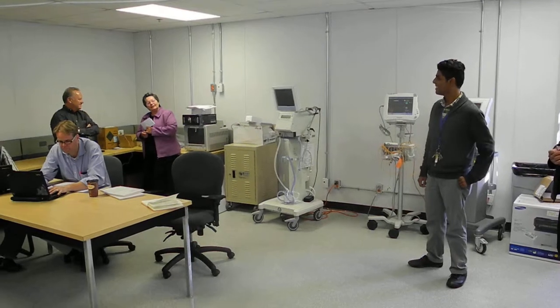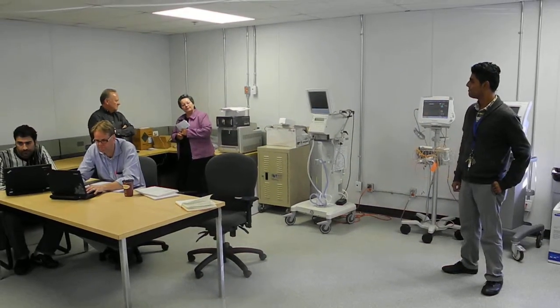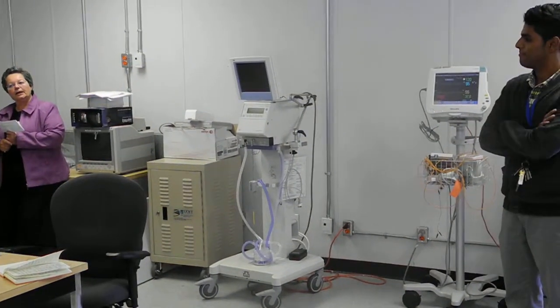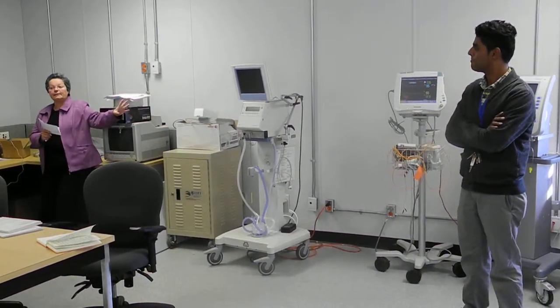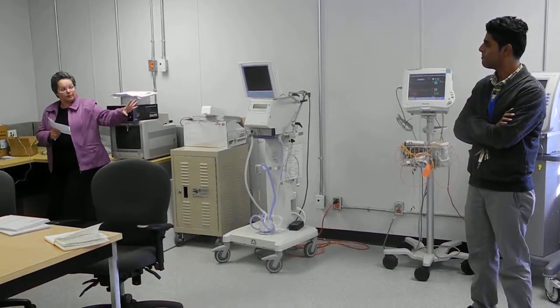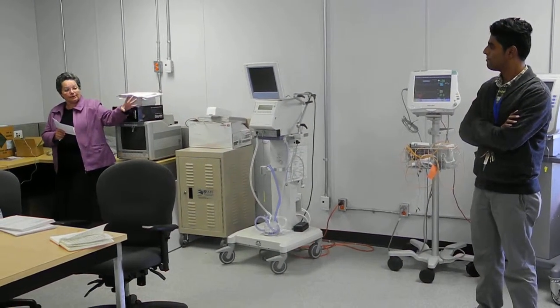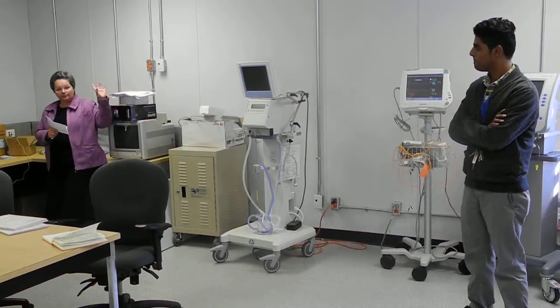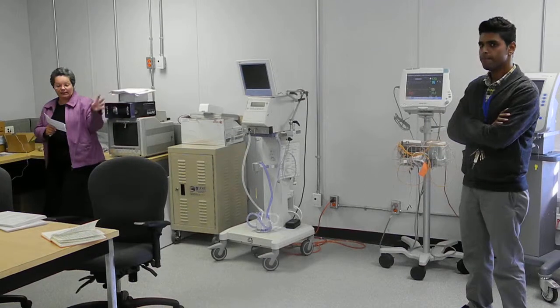The basic premise of the research is that if they can use the data as it comes from the machine, so any one of these machines produces about 8 different streams of data from each baby, constantly, continuously.